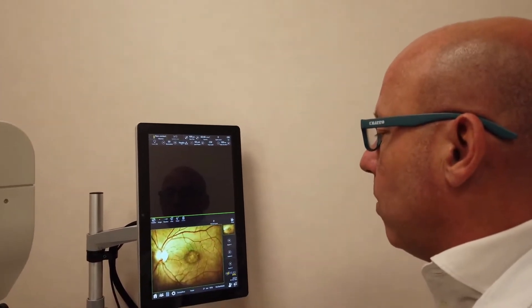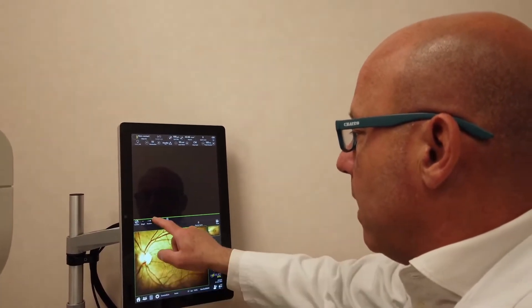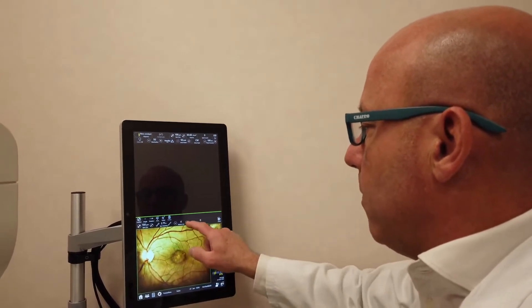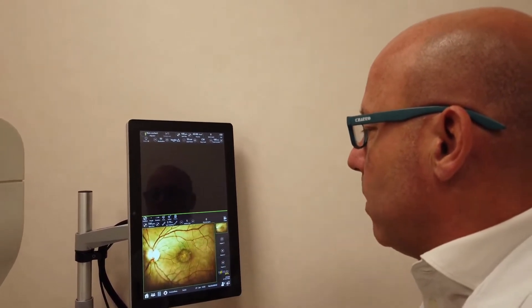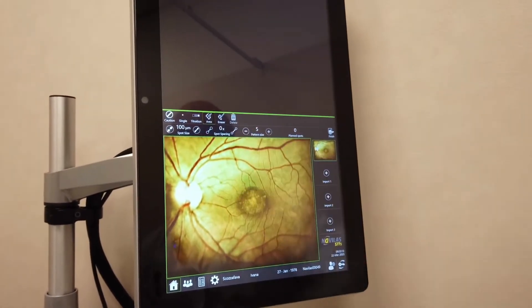Photo first. Then, having acquired the photo, we edit our treatment. We choose the type of treatment we want to do. The pattern size, which at most goes up to five. The space between each spot must be zero — this is in common with other lasers, too.